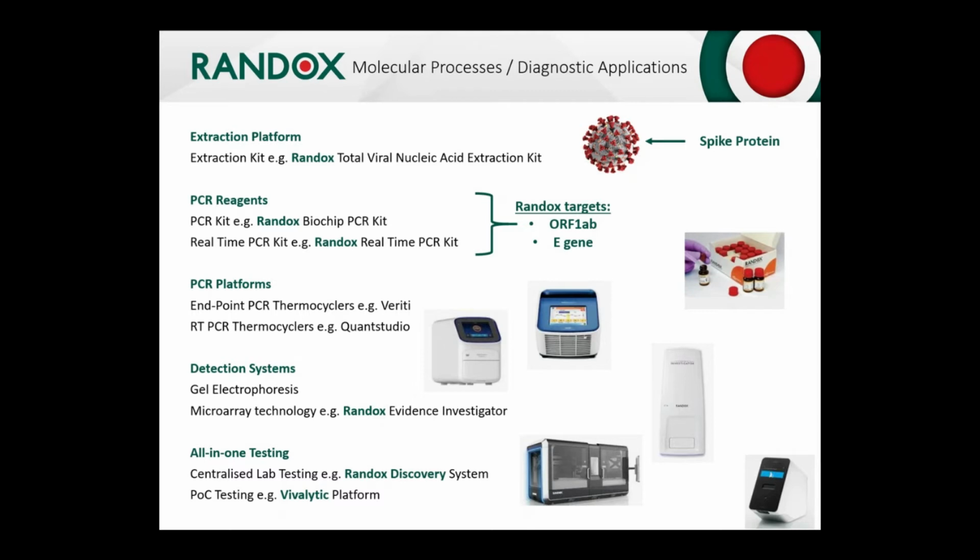Oh, I think there's huge potential for point of care testing, which may also be referred to as near patient testing, for COVID. By all-in-one, what we mean is that extraction, amplification, and detection are all contained within a single unit. That is really the crux of point of care. The idea is that a sample is inserted into a cartridge-based device, and that cartridge is then inserted into a very small portable detection suite about the size of an espresso coffee machine. At Randox, we're actually involved in the development of point of care cartridges for a system called the Vivalytic.